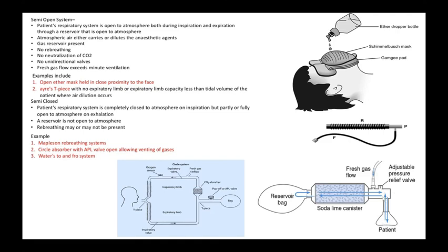Okay? So where will the apparatus dead space end in this case? In the APL. Near the APL, because that is located more proximal. Even though fresh gas flow is also coming here, it is up to this APL valve that this portion is the dead space. On the contrary, if the APL valve has gone behind here and the fresh gas flow is here, now in this situation, this is the dead space, even though there is no valve here. So remember that point for remembering the apparatus dead space.